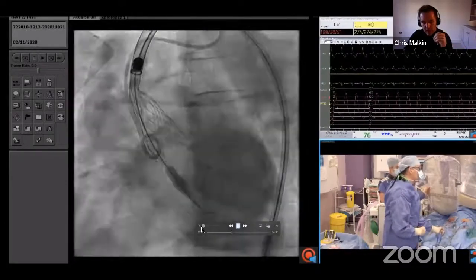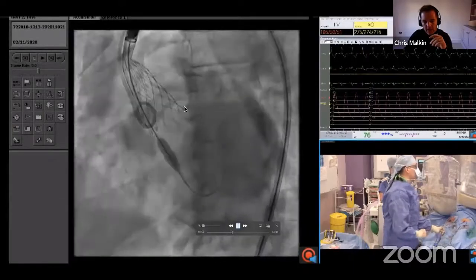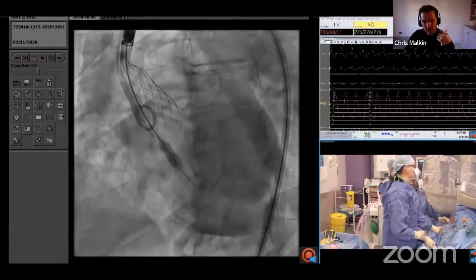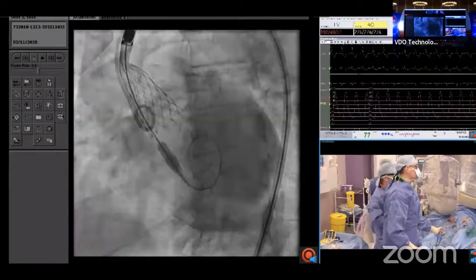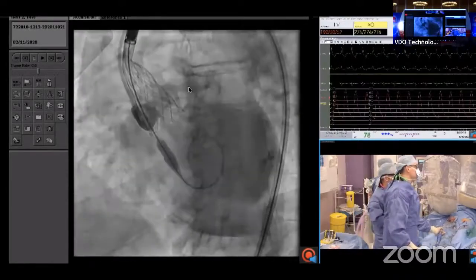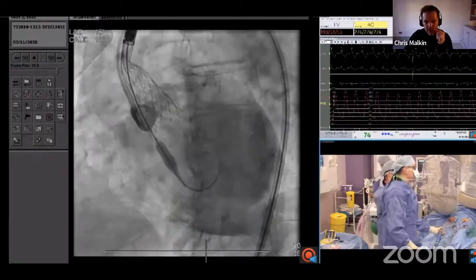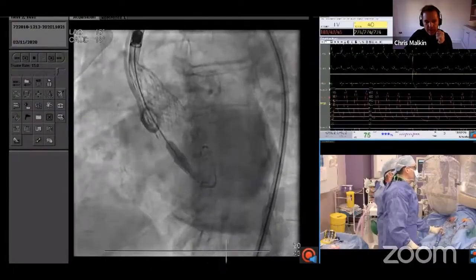We do that by going LAO towards the coplanar three-cusp view. And then we're able to assess the left coronary side of the valve. So three D structures need two dimensional images to assess them. And this looks perfect to me. It's about 2-3 millimeters on both sides. It's a really nice high implant.